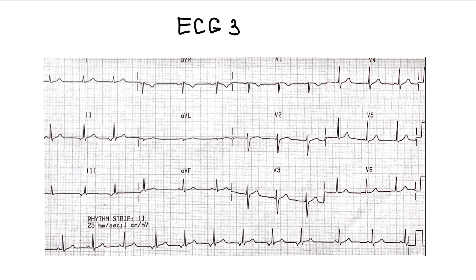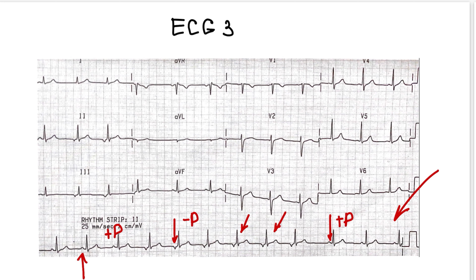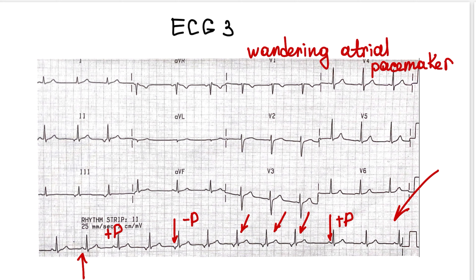Let's take a look at this ECG. What rhythm is present here? We look for the p-wave — it's there, but it varies within the same lead. We see a positive p-wave, a negative p-wave, and a different type of positive p-wave. The p-wave precedes the QRS complex, and the QRS complex is narrow, not widened or deformed. When we see different p-wave morphologies within the same lead, it's called wandering atrial pacemaker, meaning the rhythm source migrates through the atrium from one contraction to another.